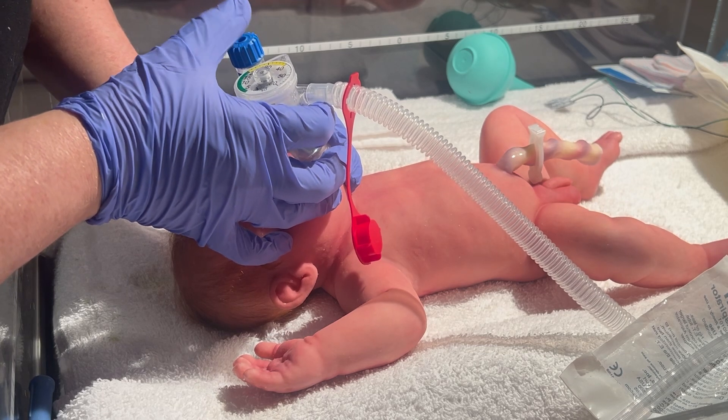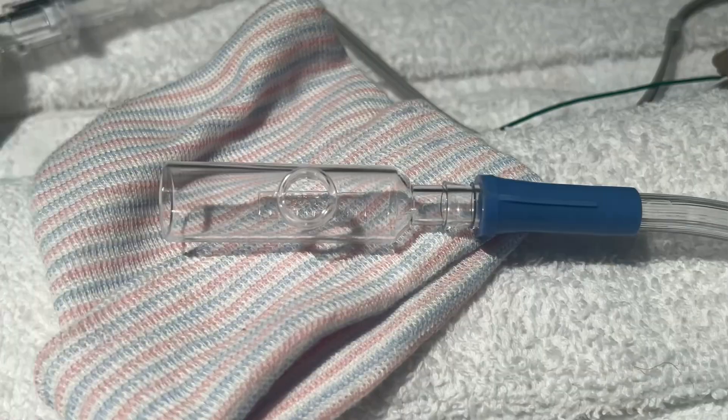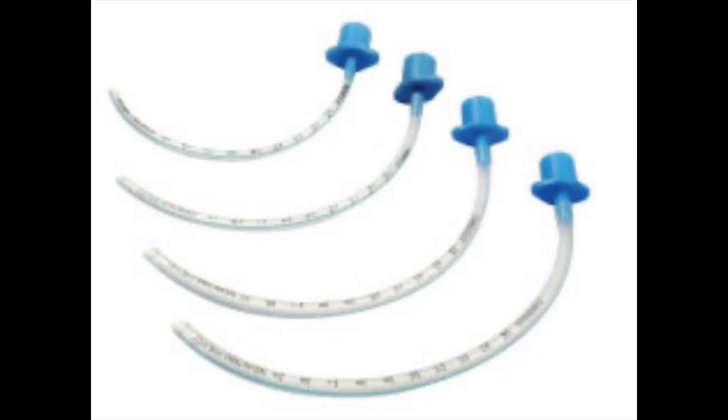At this point, it's time to switch to a meconium aspirator. The equipment and supplies needed will be the meconium aspirator and suction tubing. You will place the meconium aspirator cone end onto the suction tubing and adjust your suction to 80 to 100 millimeters of mercury.